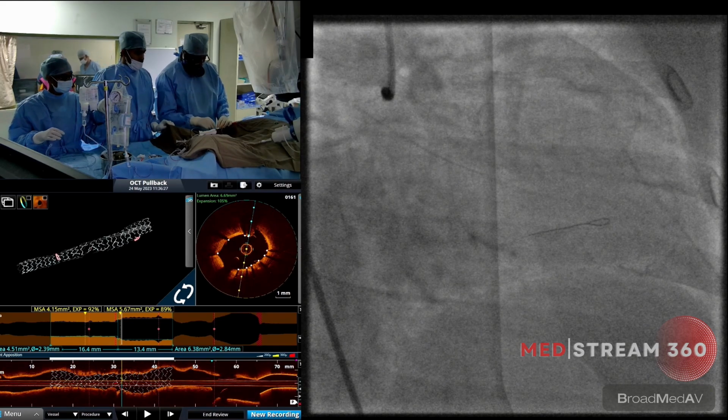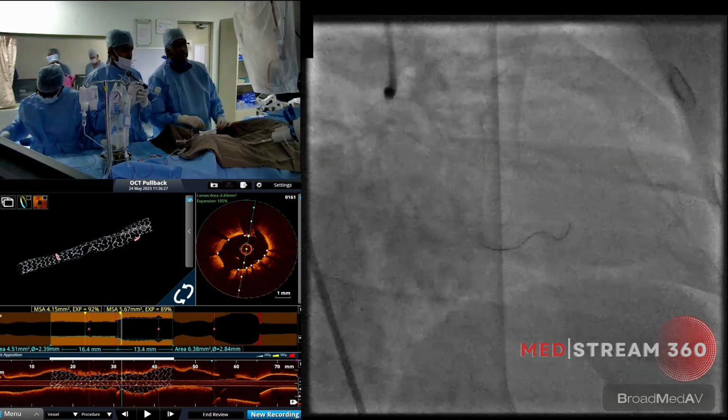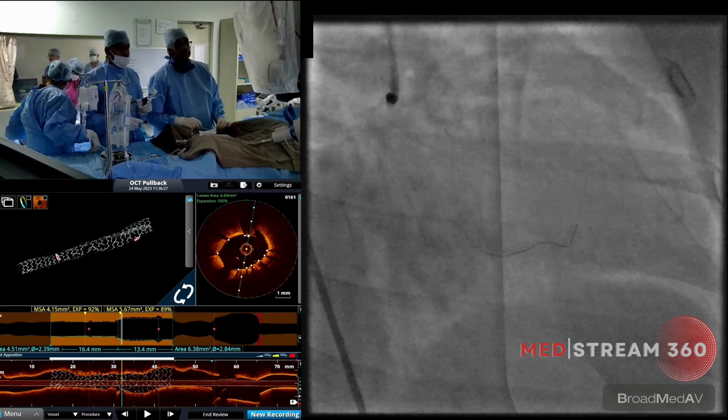Okay, so we've got the wire across. Yeah, so thank you very much. And the idea was to show the LAD under OCT.